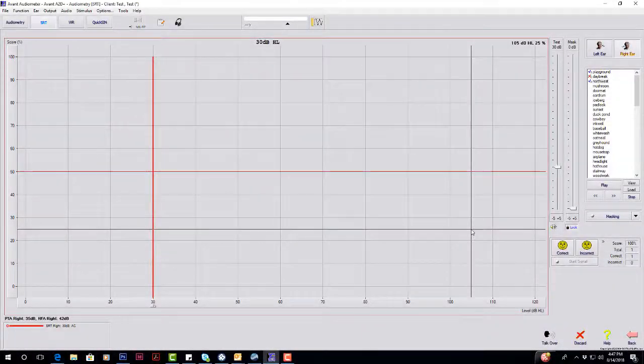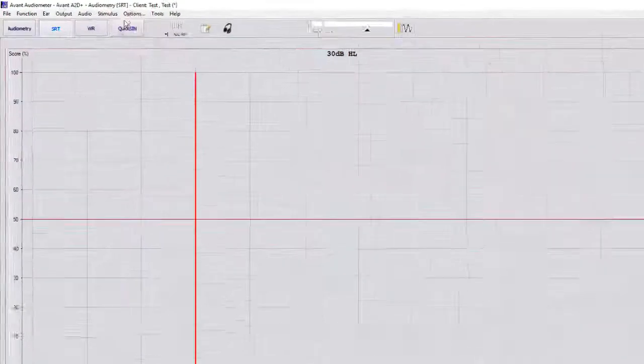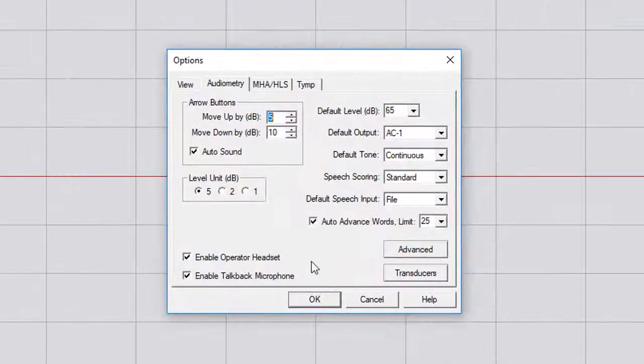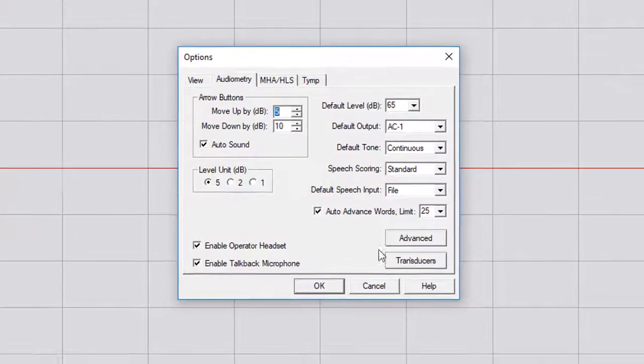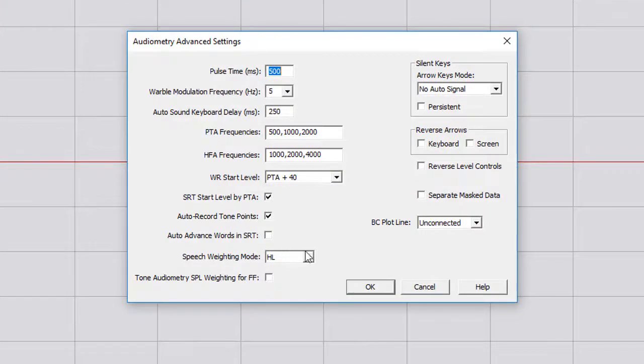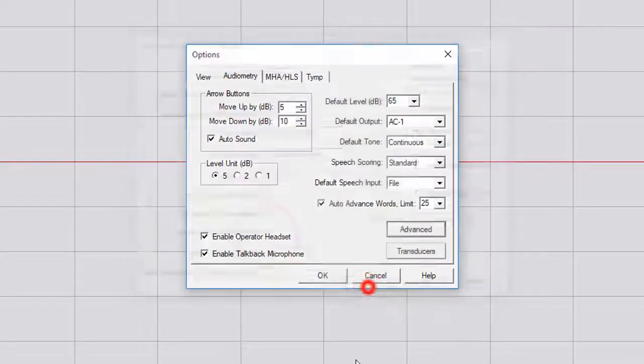There is another way that you can do this. Go to Options. You can go to Advanced. And then at the bottom here, we have Auto Advanced Words and SRT. If we select that and hit OK.